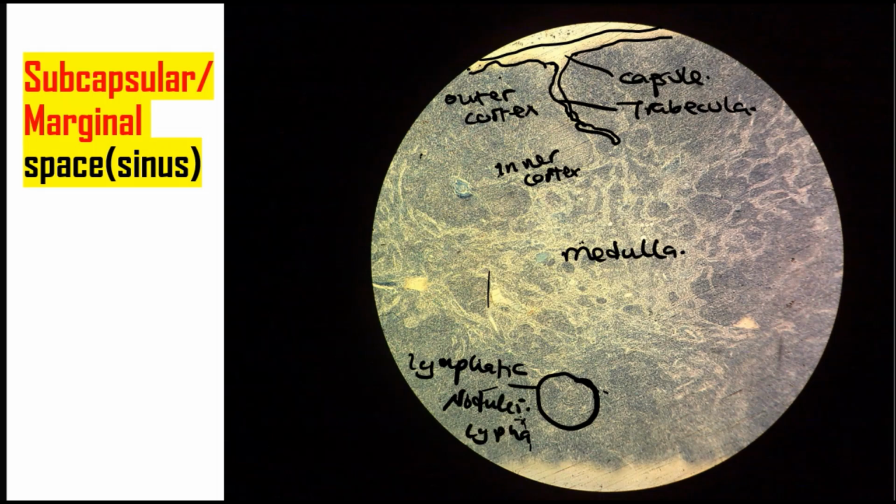Now, one thing of note is that the lymphatic nodules in the lymph node do not have the central artery. That's the differentiating factor between the lymphatic nodules in the spleen and the lymphatic nodules in the lymph node. And as you can see, the lymph node is separated into the cortex and the medulla, while in the spleen there was no division like that. So that's one other difference.